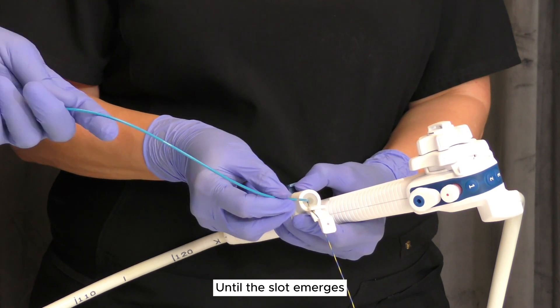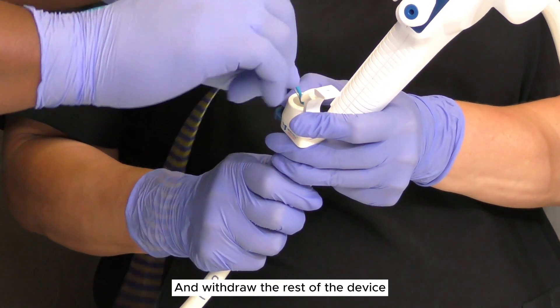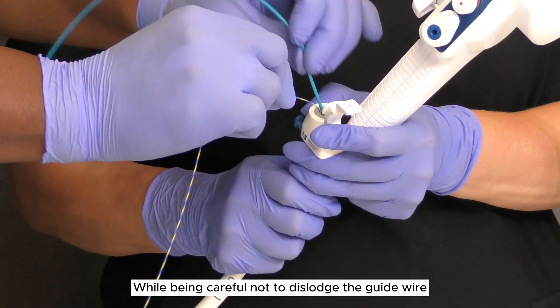To remove the balloon from the endoscope, withdraw the device over the guide wire until the slot emerges. Unlock the guide wire from the locking device and withdraw the rest of the device over the guide wire, while being careful not to dislodge the guide wire.